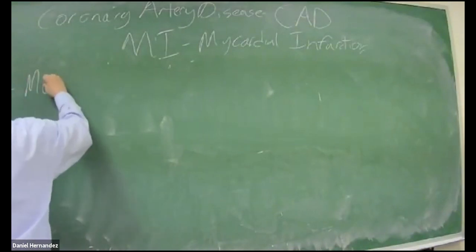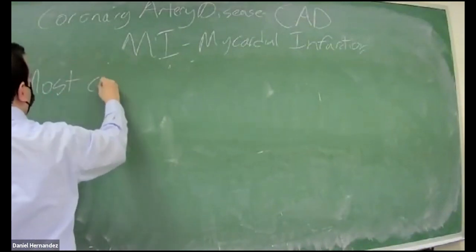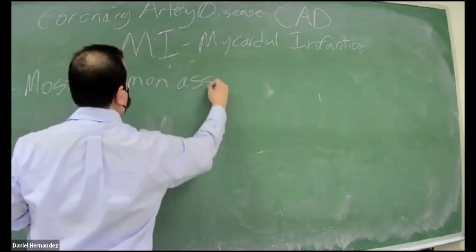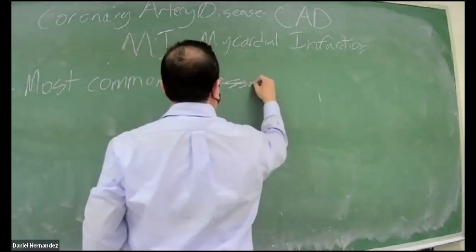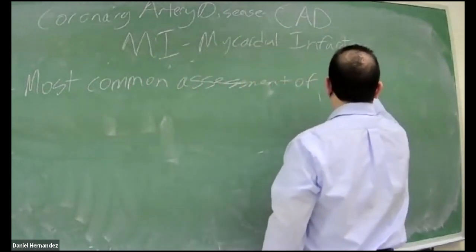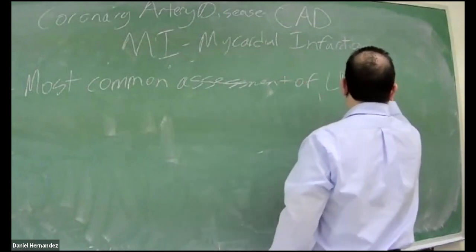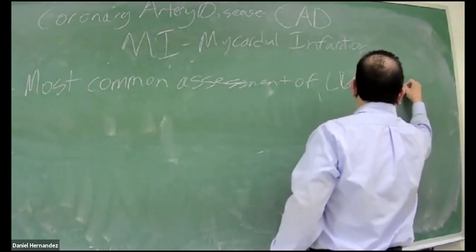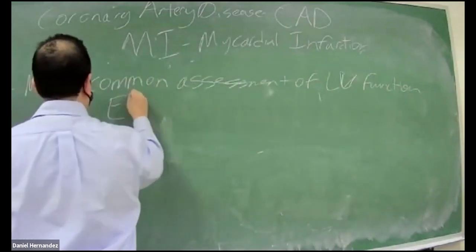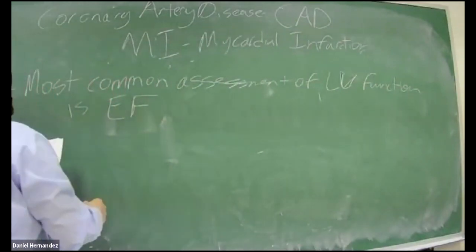The most common assessment of LV function is your EF, ejection fraction.